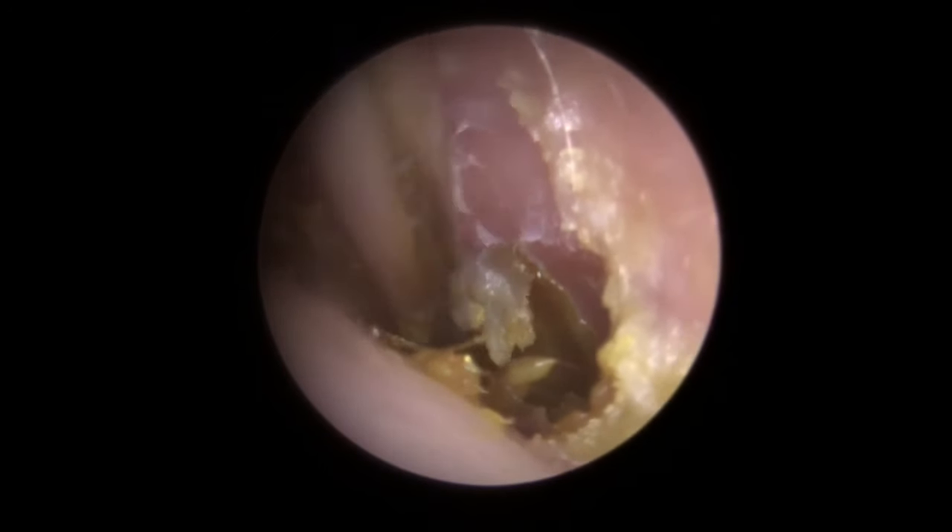So this is our next patient in the compilation — much, much easier. This is also a skin issue. We can tell it's skin because it's very ripply around the outside edge and it's got this almost greyish colour to it. So patient's come through really not hearing very well — has very little hearing on one side and this is the better ear. So really blocked up. But you'll see as we get a grip on this, it starts to pull the whole section forwards. So we're just going to get a grip on the rear of that and start working this out.